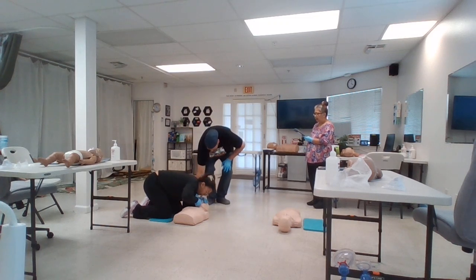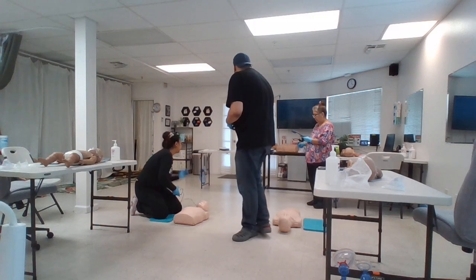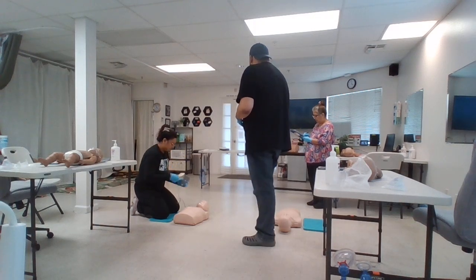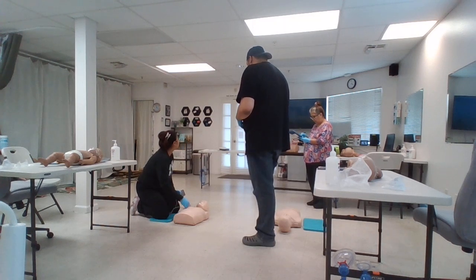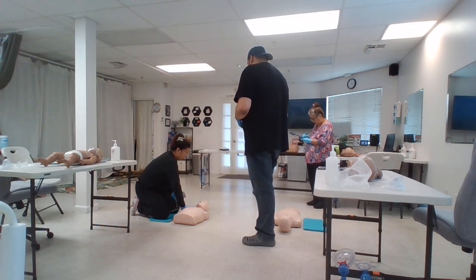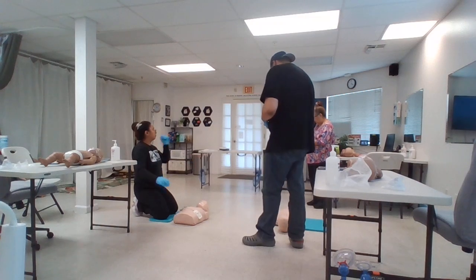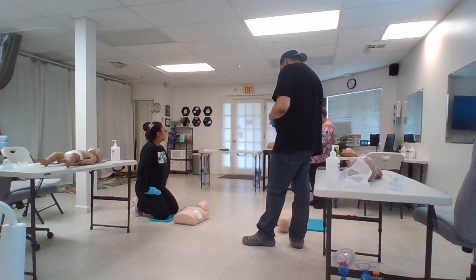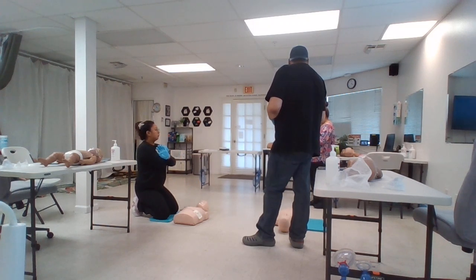Give the AED. Adult patient. If the patient is a child, press the child button. Apply pads as shown in the pictures. Press pads firmly on skin. Do not touch the patient analyzing heart rhythm. Do not touch the patient analyzing heart rhythm.